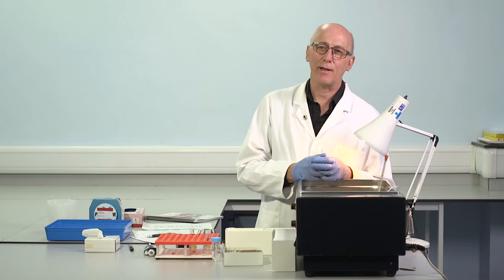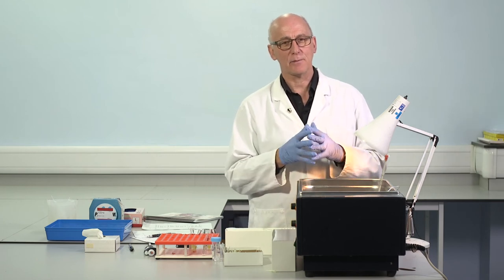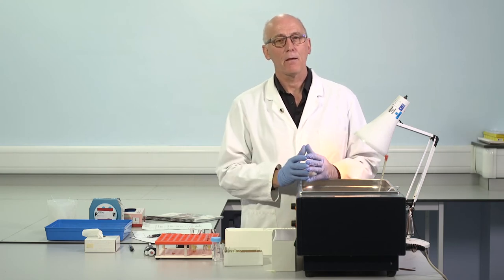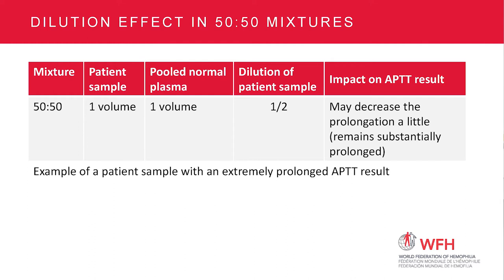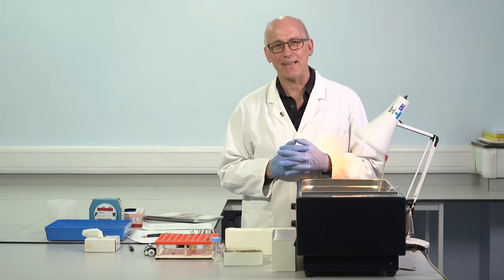And a common feature of lupus anticoagulants, this type of inhibition occurs straight away. As soon as the mixture is made, the antibody is able to exert its effect, and the long APTT typically remains prolonged. There's a dilution effect. Remember, we've mixed one volume patient plus one volume of pooled normal plasma. So there is a dilution factor for the patient sample where the antibody is contained, dilution factor 1 in 2. So this can reduce a little bit and have some impact on the APTT, so we may see some movement from its extreme prolongation. It may move in the direction of the normal range, but remains usually substantially prolonged. So we have to look in some detail at the results.